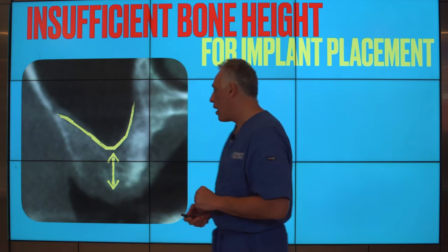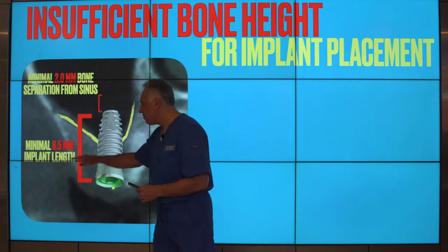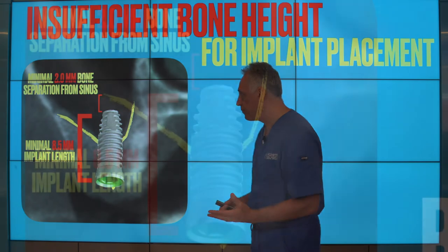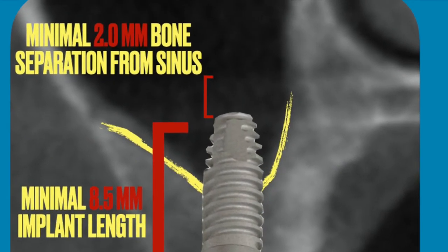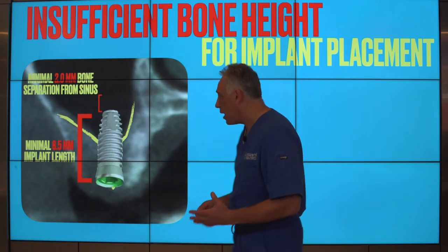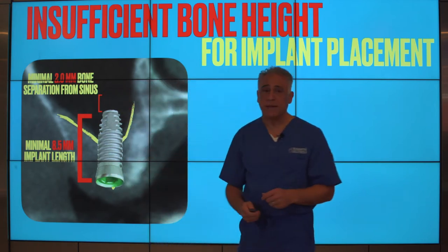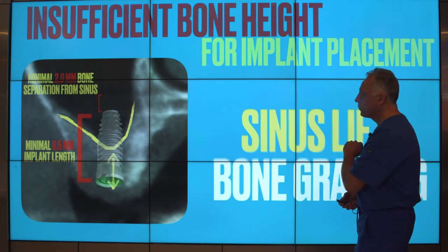And here's the reason why. We do require a minimal 8.5 millimeters of implant length for sufficient support of the restoration. And we also recommend a minimal 2 millimeters of bone separation from the sinus. And if we don't have the adequate height for this dimension and the support of this implant, then a sinus lift bone grafting is recommended.